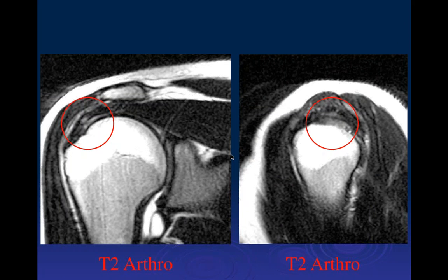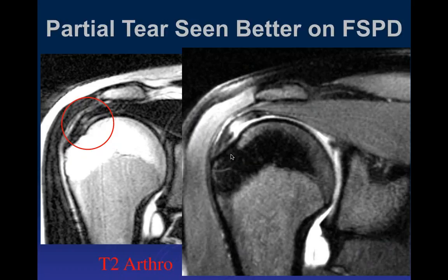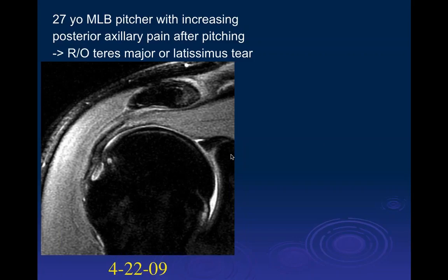Sometimes when surgery is done, the surgeon doesn't probe enough. They see that everything looks smooth, and then they think that all is well. If they put a probe in this, they could probably find a degenerative tear. Okay. Good. I mean, not a complete tear, but yeah, partial. Be able to find the interstitial component.